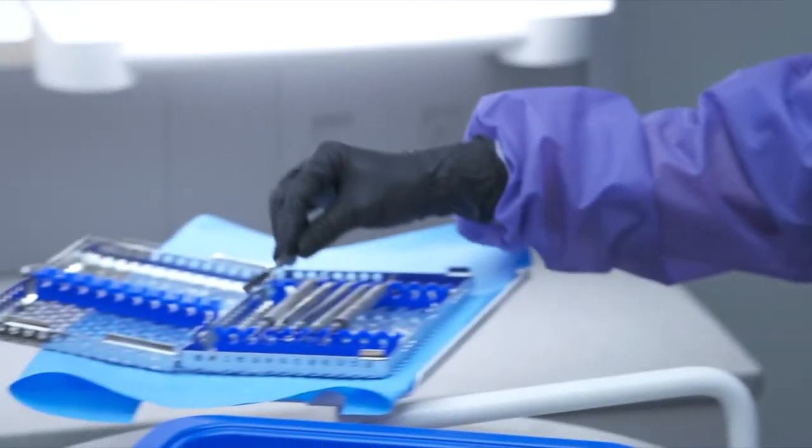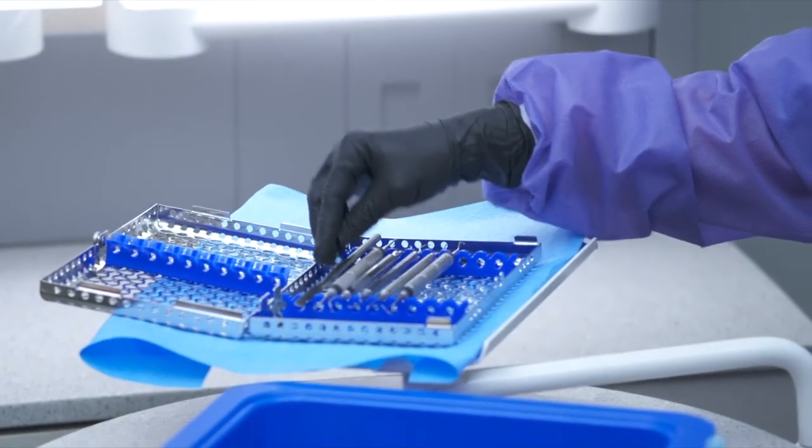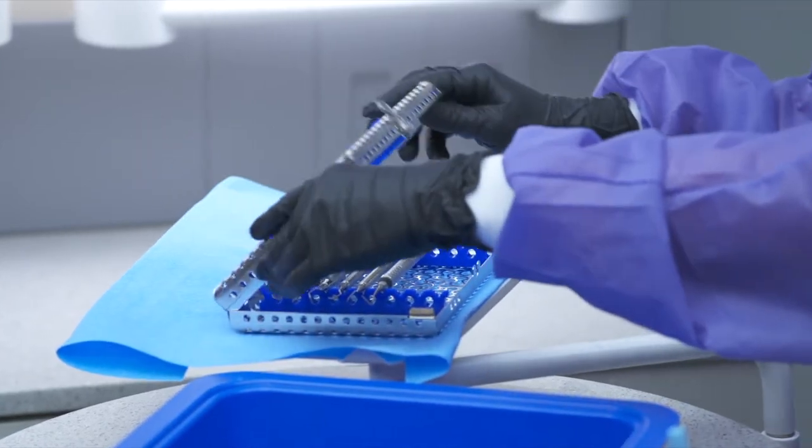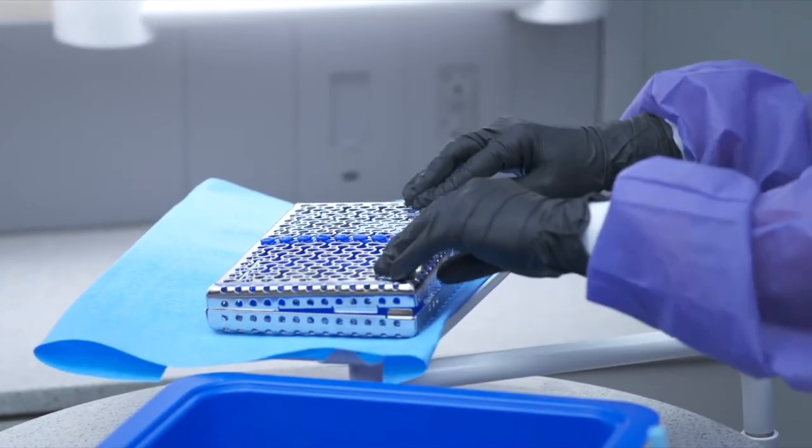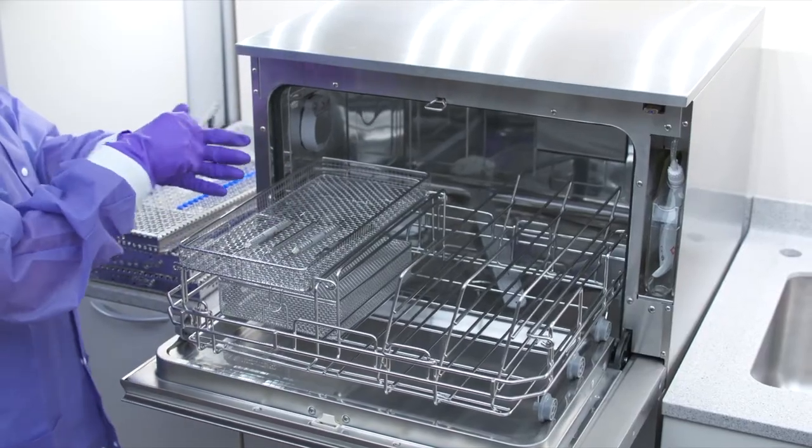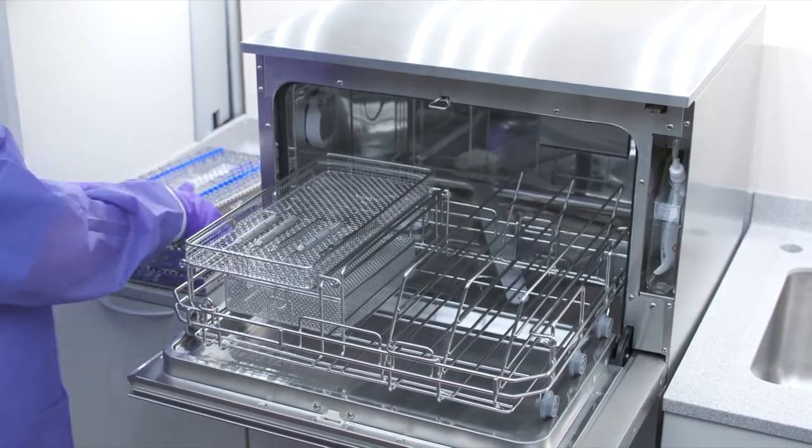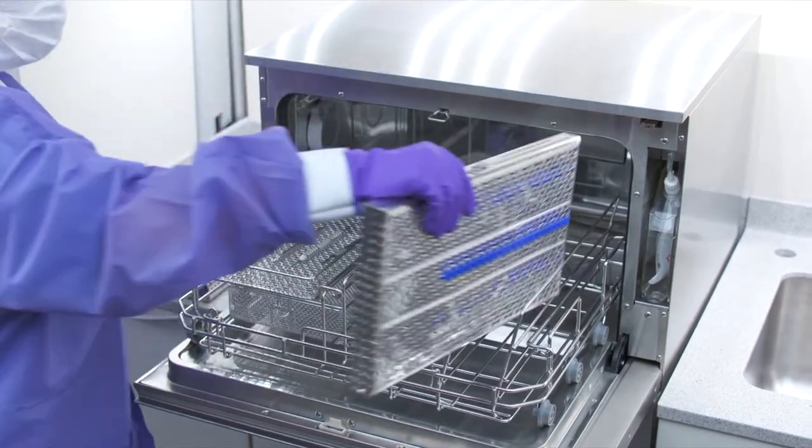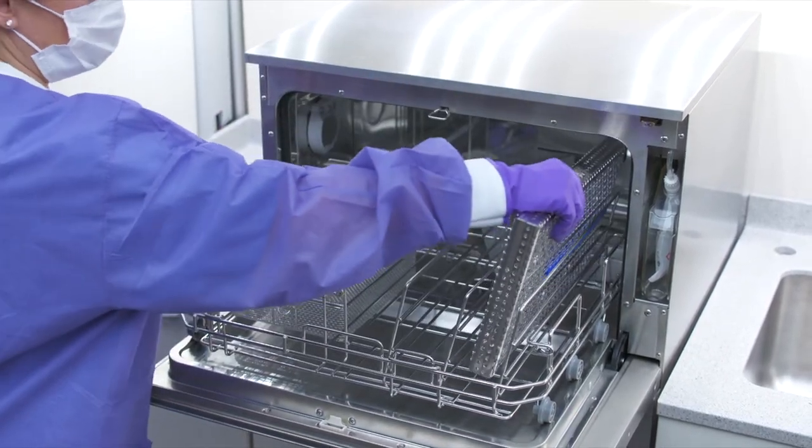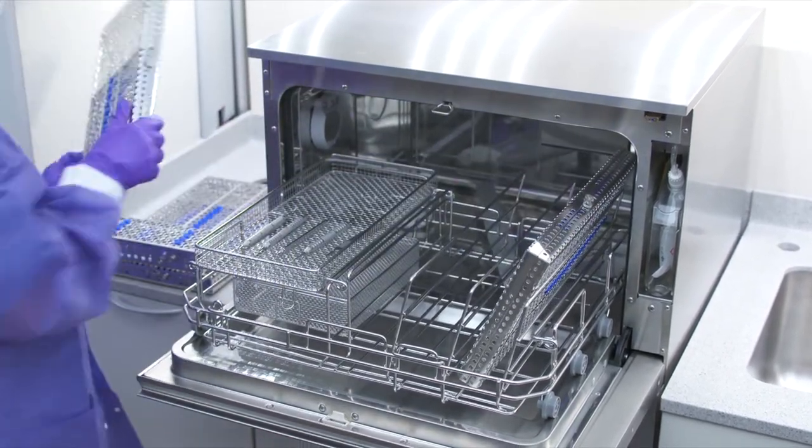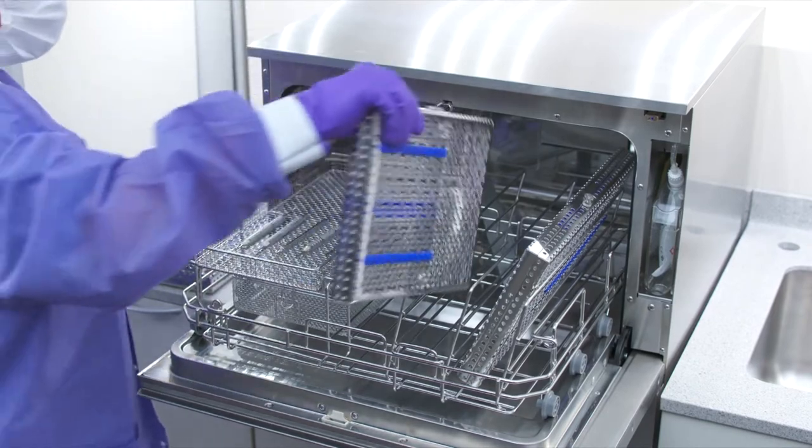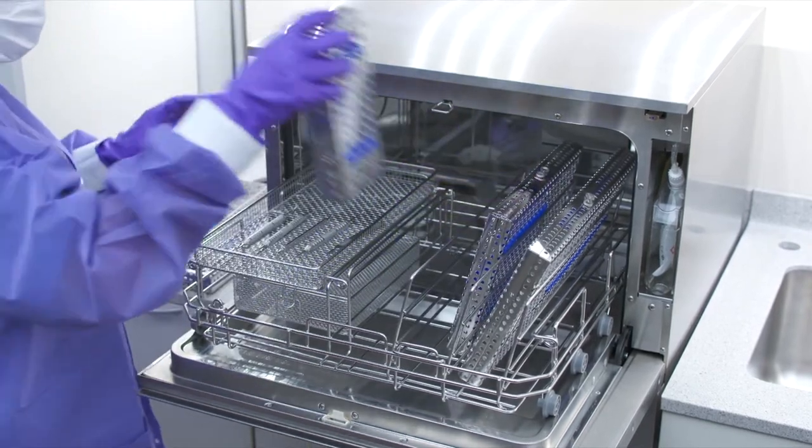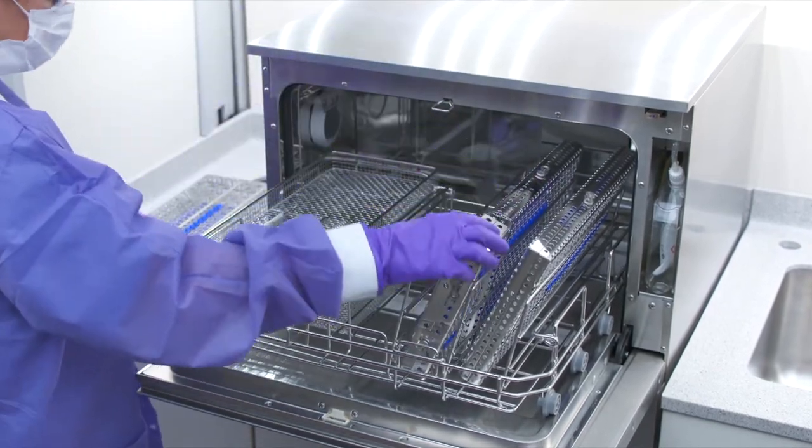Depending on the type of instruments, place them either in instrument cassettes or in one of the baskets that came with your Hydrum. Place trays and other concave-shaped items at an angle to ensure water can run off surfaces easily. Never place cassettes flat in the loose instruments area.